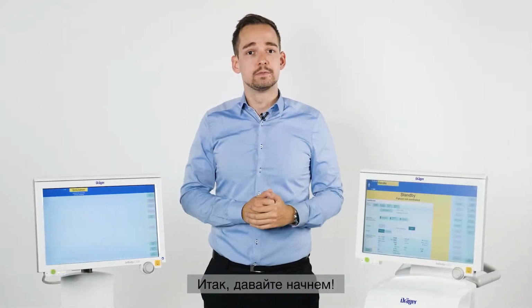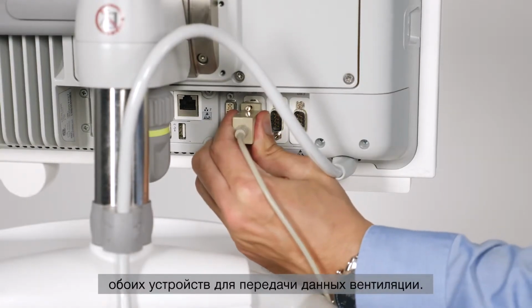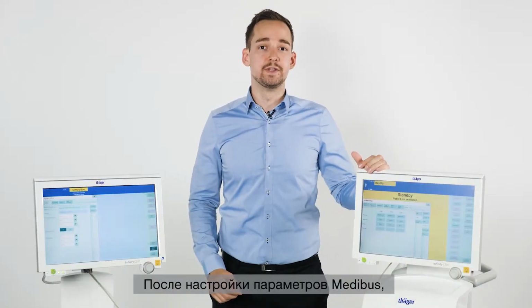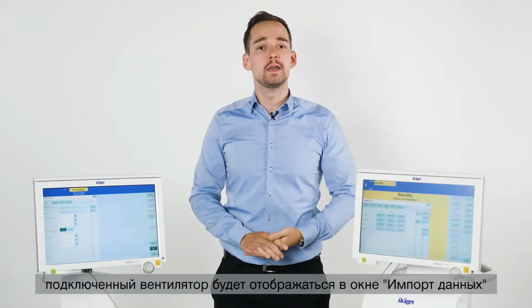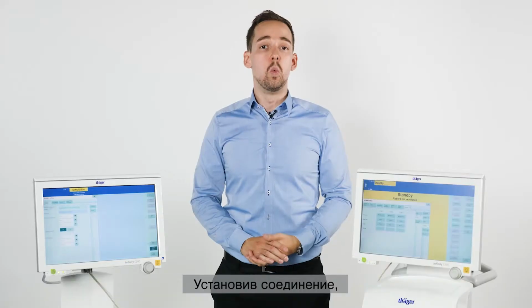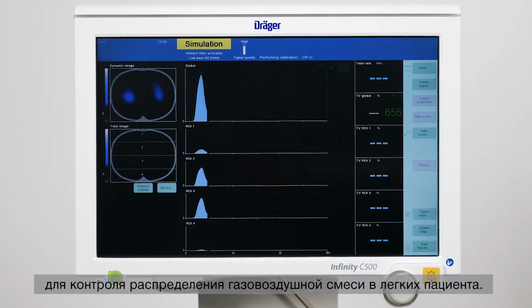So let's get started. First, we need to establish a connection between the Evita and PulmoVista. All we need is a Medibus cable which is connected to the COM ports of both devices to transfer ventilation data. After setting the Medibus preferences of the ventilator to the following settings, the connected ventilator will be displayed in the data import window of PulmoVista together with the imported ventilation data. Once a connection is established, we can start an EIT measurement by PulmoVista to monitor the patient's ventilation distribution.